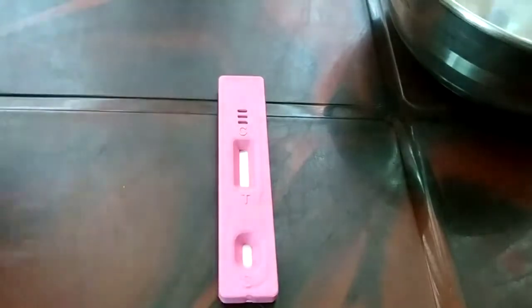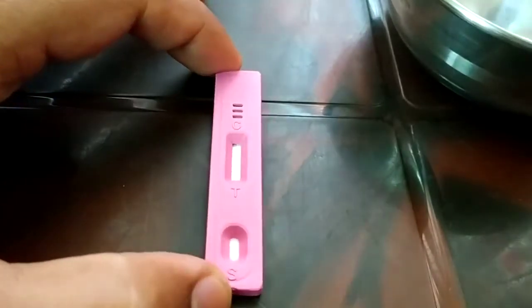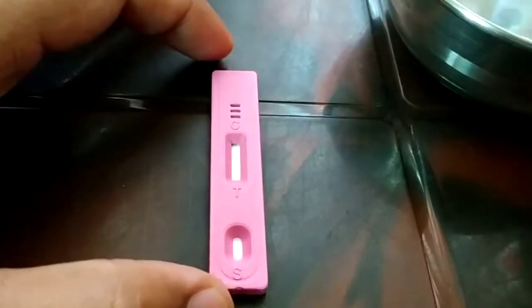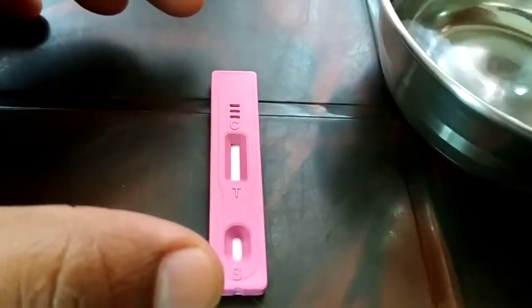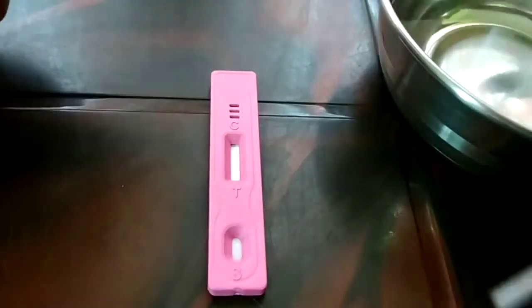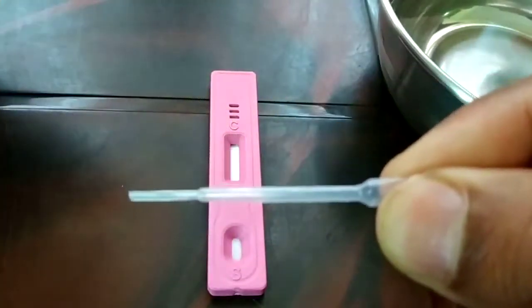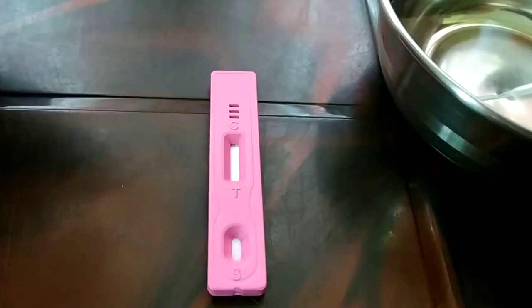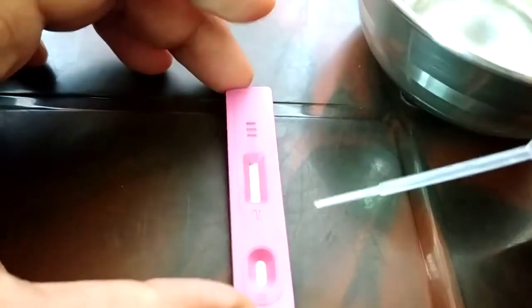Early in the morning you're going to take a fresh urine sample. Then you have the dropper device — just press it so it absorbs the liquid, and then drop it into the sample.